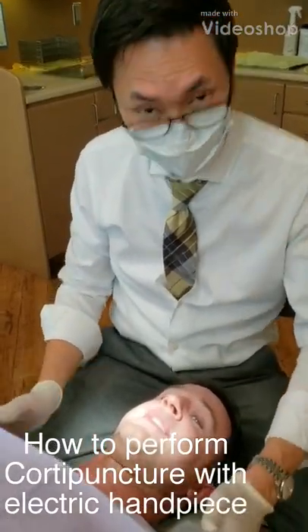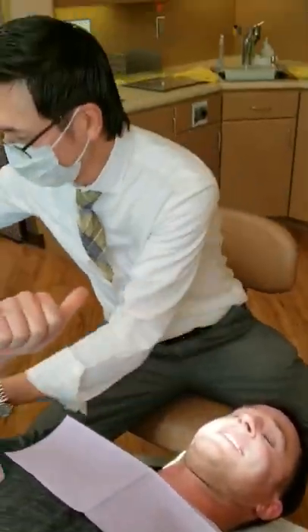Hey everyone, this is Dr. Ting. This is Dr. Alexander, another orthodontist from San Diego. We're going to perform the corticopuncture for him this time.